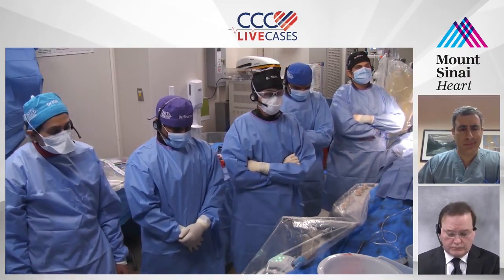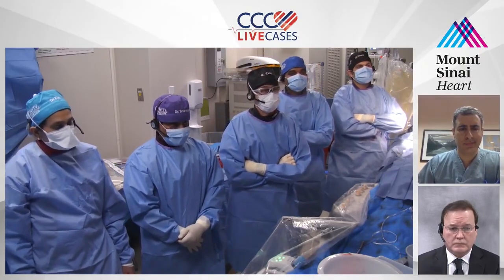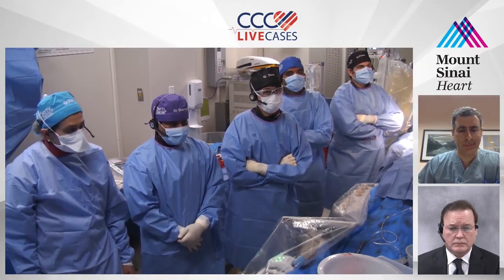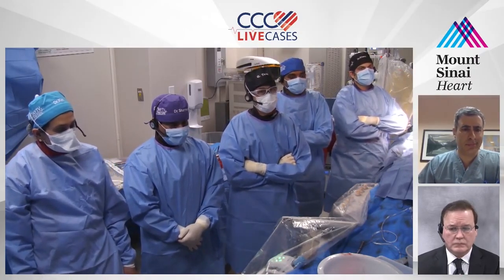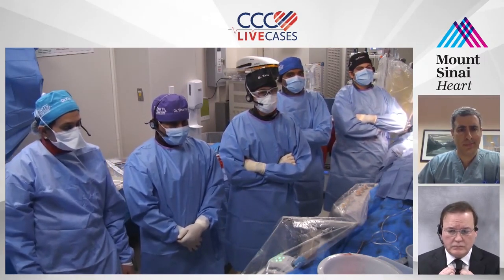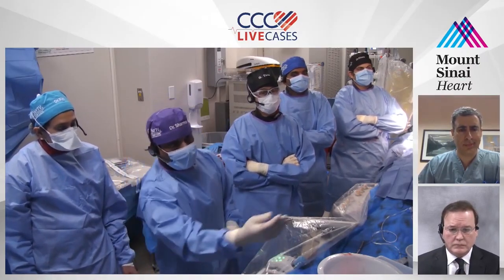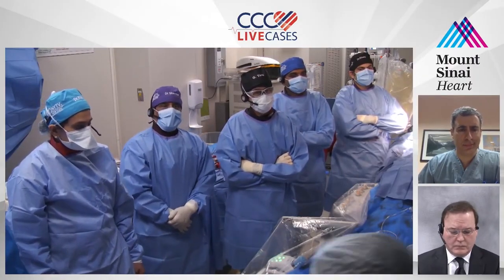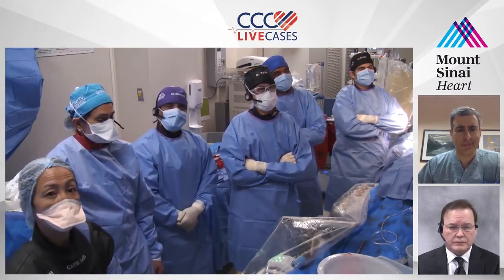If you don't have that, then your navigation, even if you have fully flexed the Edwards valve, is not going to get into the correct position. So that is why we took meticulous time and showed the steps, how you get your wire in the right position, which we did. And subsequently, everything went one by one. All right, Neil, words from you, and then Pedro will conclude.